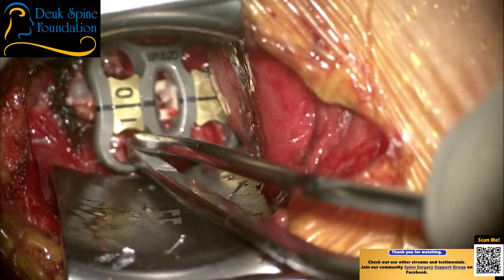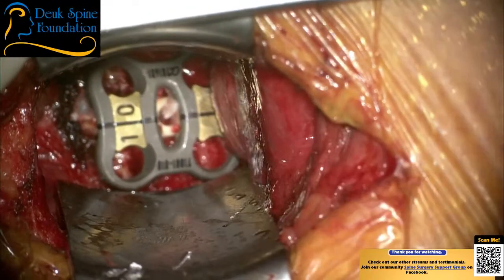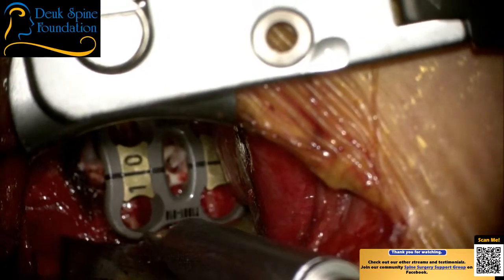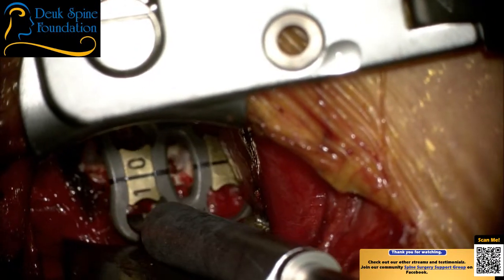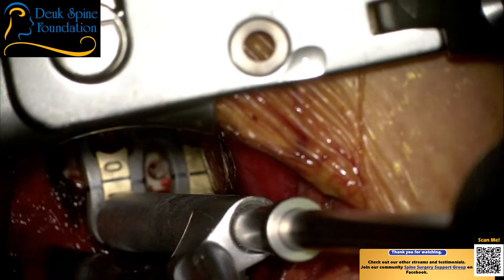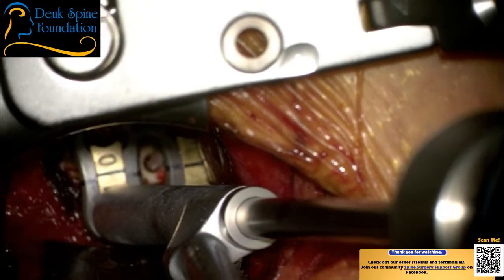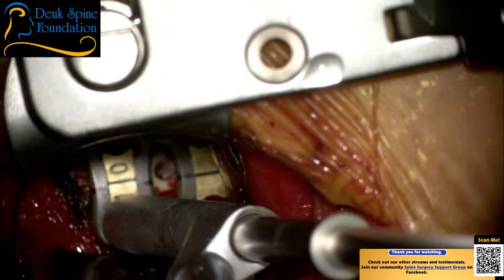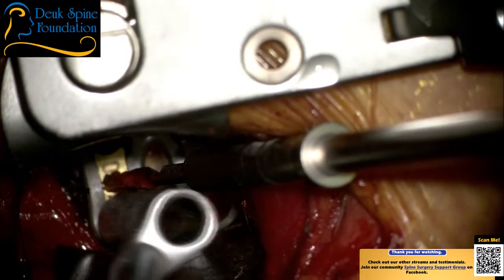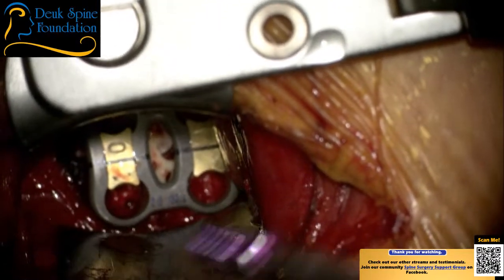So I look for, in the window, there should be half the bottom of the bone and half the cage on both ends. Basically, she should see half and half. Now, these things like to move around a little bit, so I have to try to stabilize it here. A mistake is to push down hard initially with your drill bit. I don't do that. You have to come down gingerly. What that means is you just barely touch as you go in, otherwise your plate will start shifting all over the place. It's a little trick.